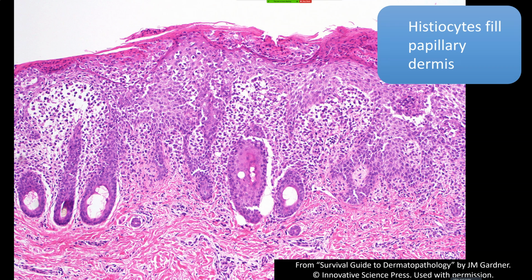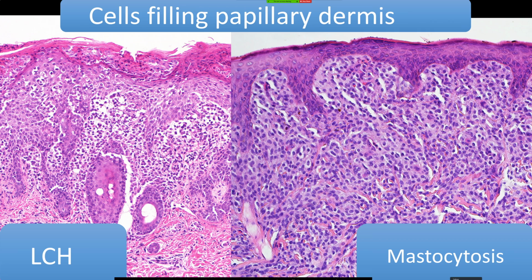I certainly have seen times where a case of Langerhans cell made me think of those things. And also, guess what? They're S100 positive. So if you made a mistake and you did S100 and thought, oh, it's S100 positive, could be melanocytes. I mean, usually you wouldn't make that mistake, but do keep in mind that occasionally it could get confused. So the infiltration of the epidermis is usually present. I have seen times that Langerhans cell histiocytosis did not have that, but it's usually there.